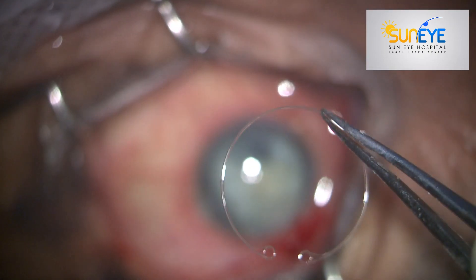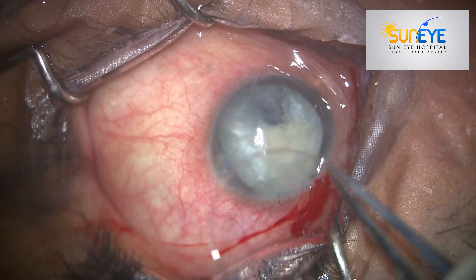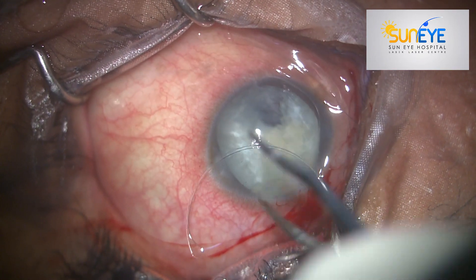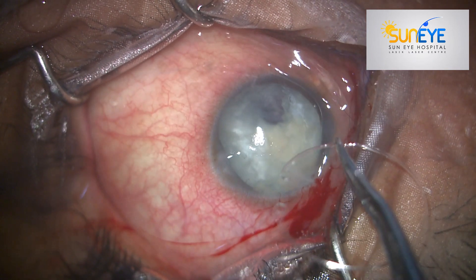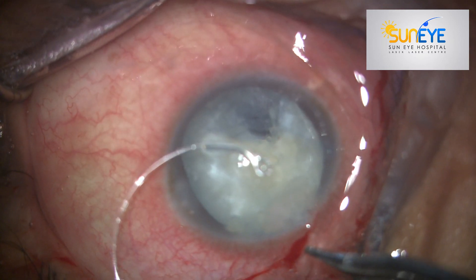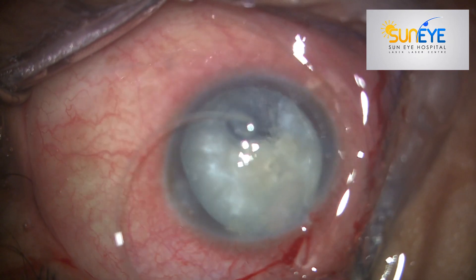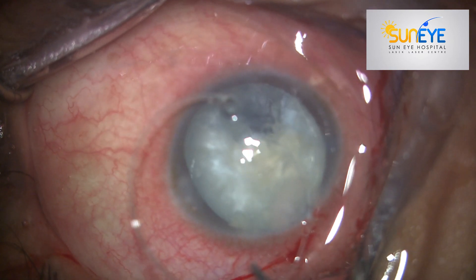Always keep these gadgets — endocapsular tension rings or such gadgets — ready in your theater, because during an emergency you may require those things. The key tip is that always insert the endocapsular ring towards the direction of zonular weakness.